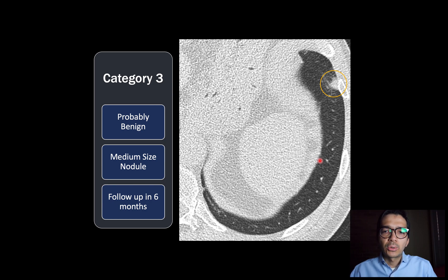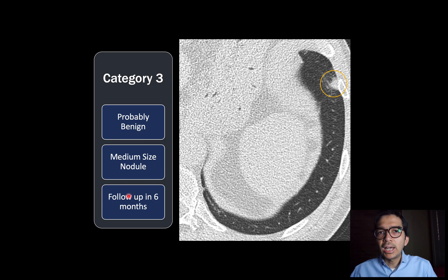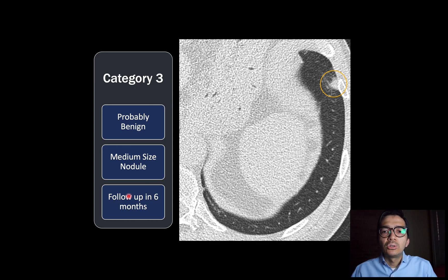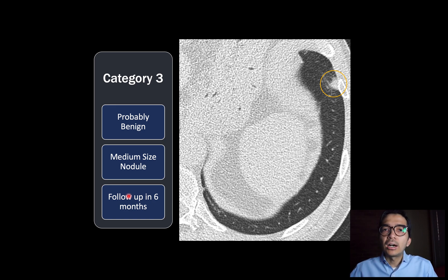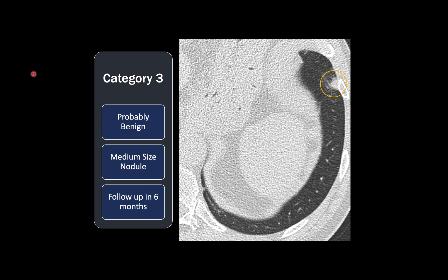Here's another example: this nodule was about seven millimeters in size — we called it medium-sized, probably benign, and asked the patient to follow up in six months. This brings up another important point: on your first lung cancer screening study, you might be asked to come back in three or six months, and that doesn't necessarily mean you have cancer. It just means we don't have a baseline study to confirm the nodule has been there a long time. On subsequent studies, we have that baseline and can say the nodule has been stable and is likely benign.